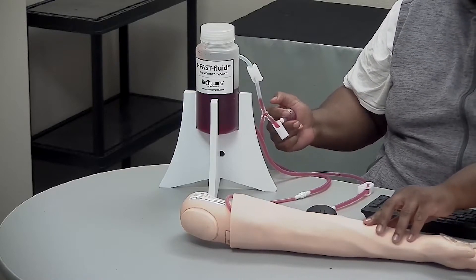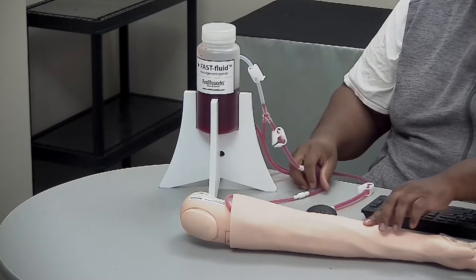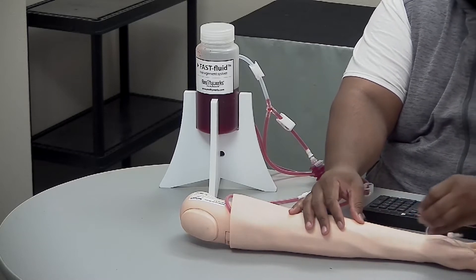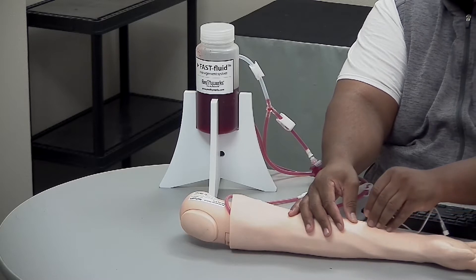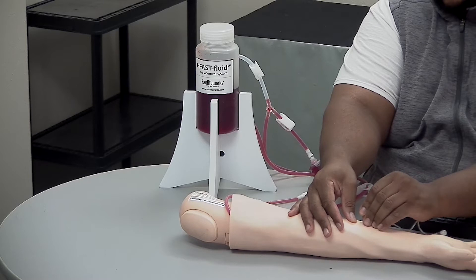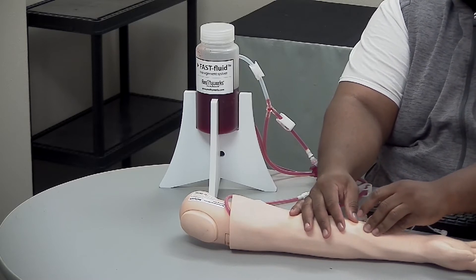Once you find that pulse, you'll be able to anchor it with your thumb. Take your butterfly needle and you'll want to enter the vein at a 10 to 30 degree angle, and once you're in you will see the flashback in the tubing, at which point you're good to go.